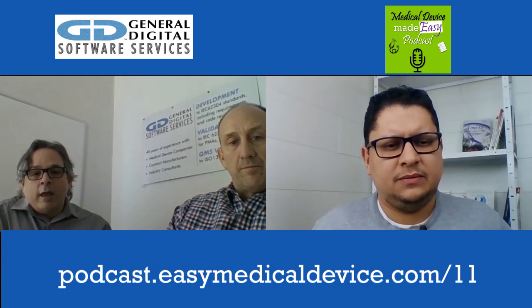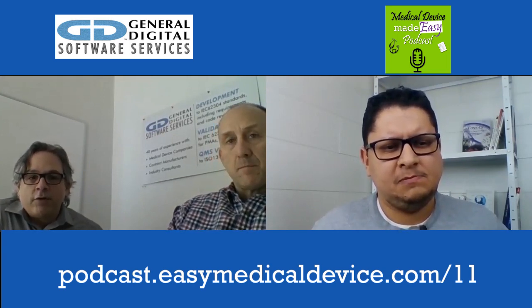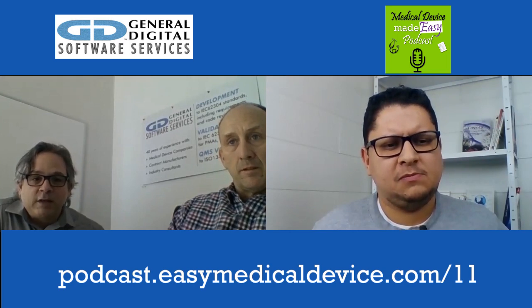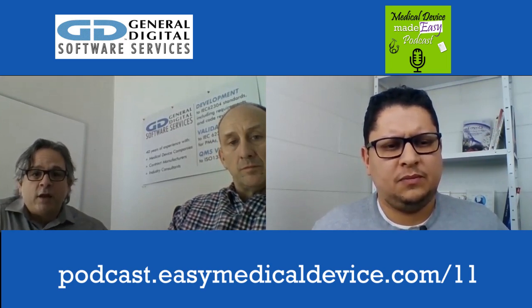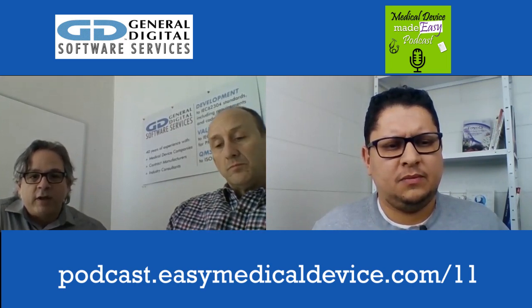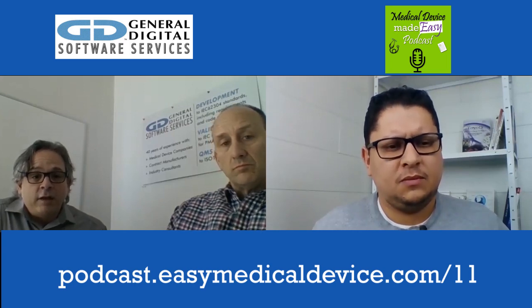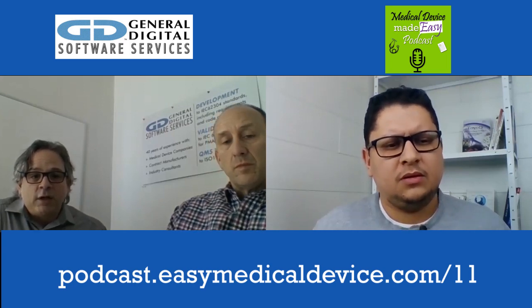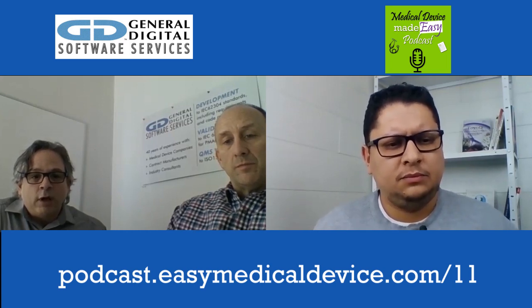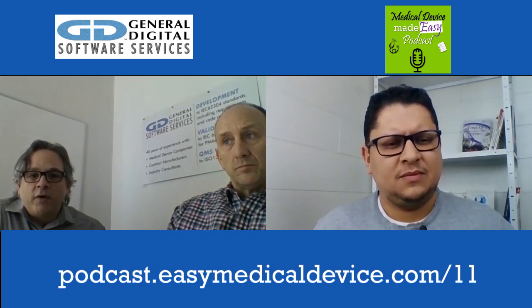Yeah. And in terms of validation, you want to do validation all throughout the development process. In terms of 13485, you want to make sure that all the software tools being used by the development team and the verification team are also validated. Any tools that you use that are going to affect the output of any process, you really want to look at their validation with risk analysis behind it.